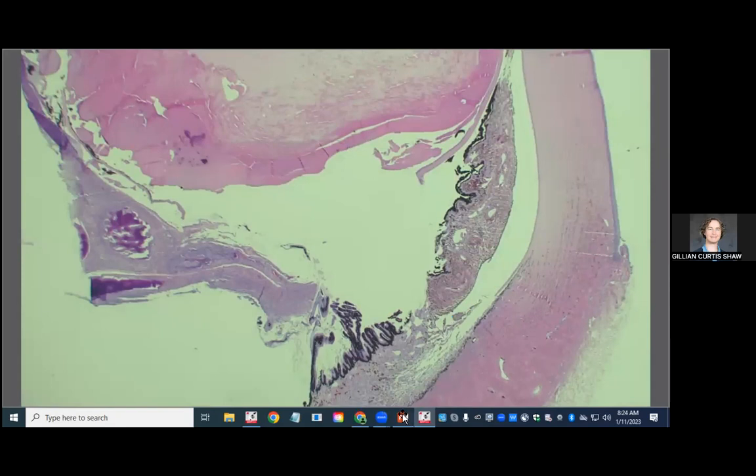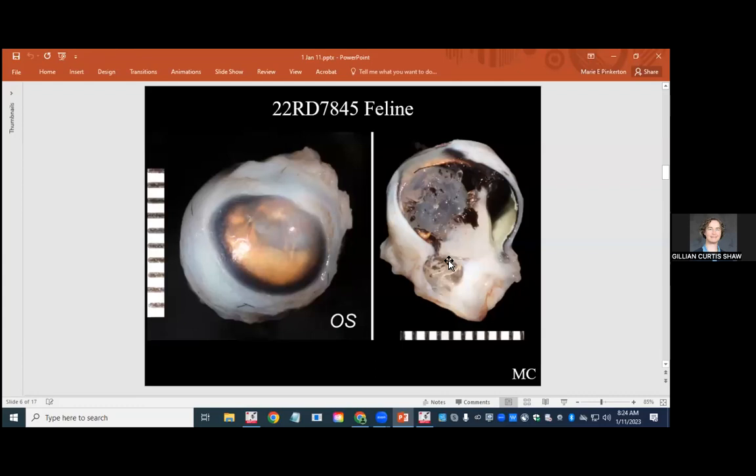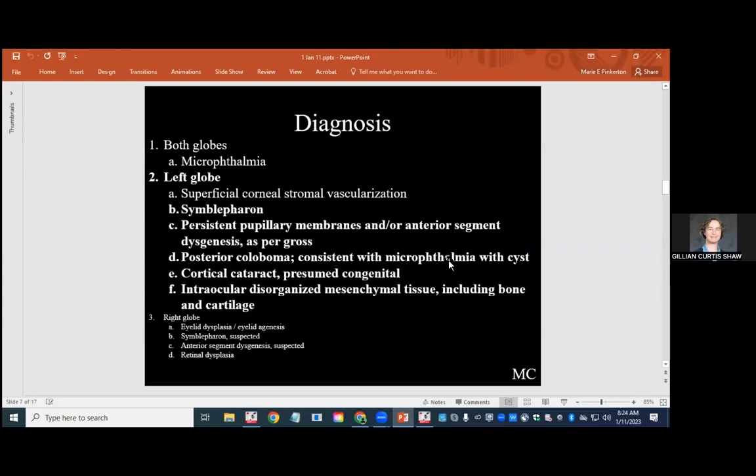Let me go here. That's this case. Basically just a constellation of congenital malformations. The other eye was fairly similar, just not as good of an example. Especially a good example of a coloboma, thought we would show that to you for eye embryology. That's it.